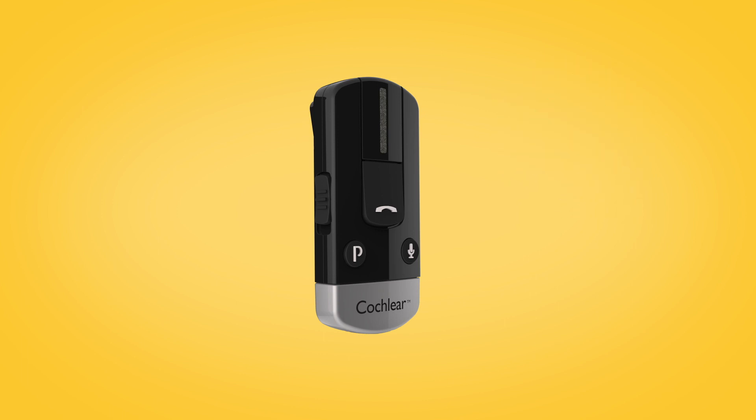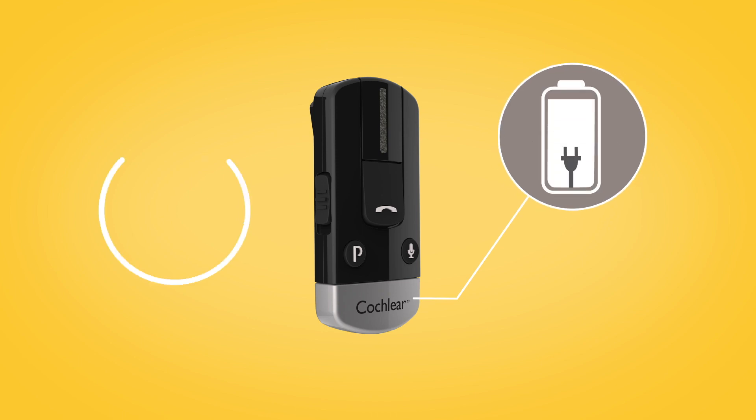Before using your foam clip for the first time, make sure it has been charged for at least three hours, even if the light indicates a full charge.